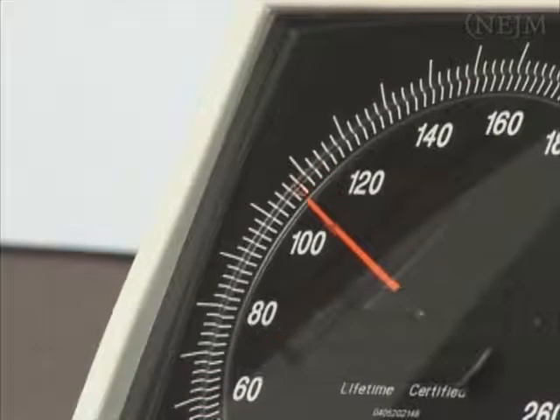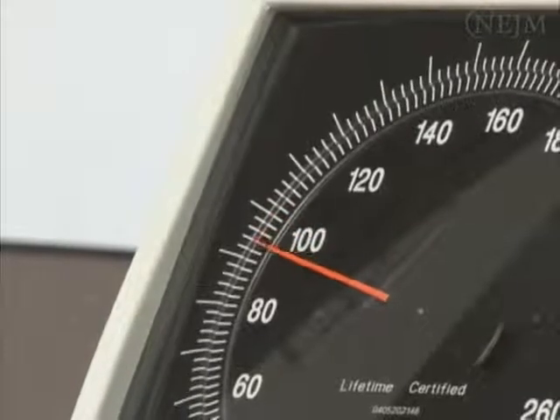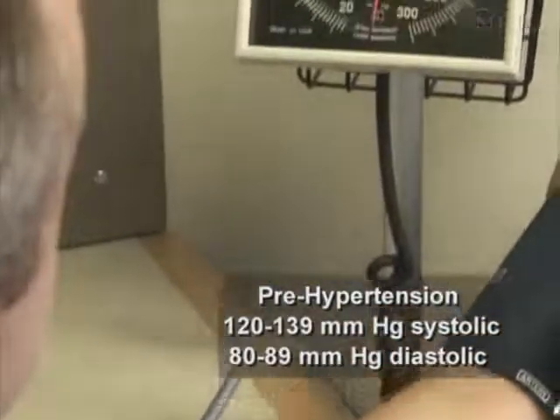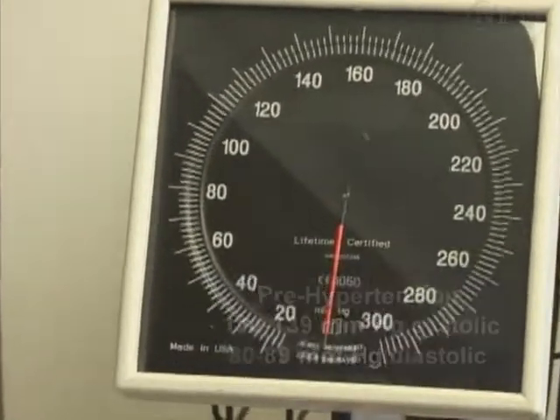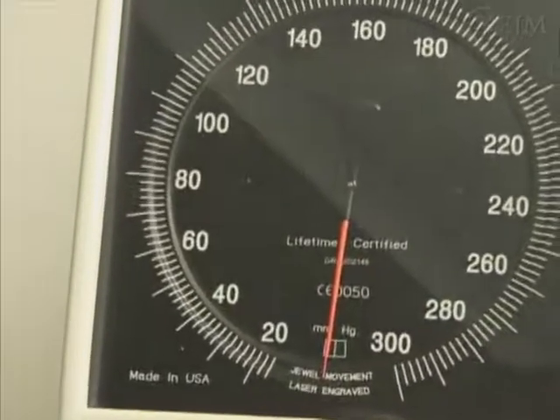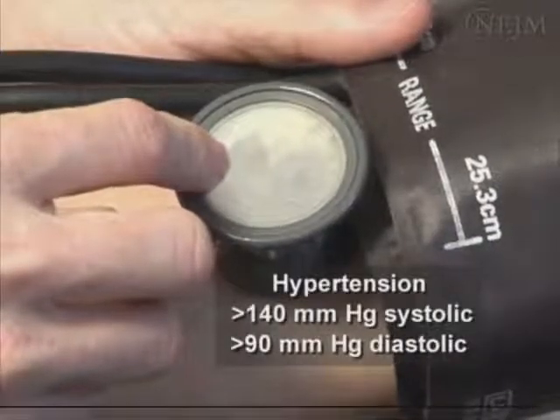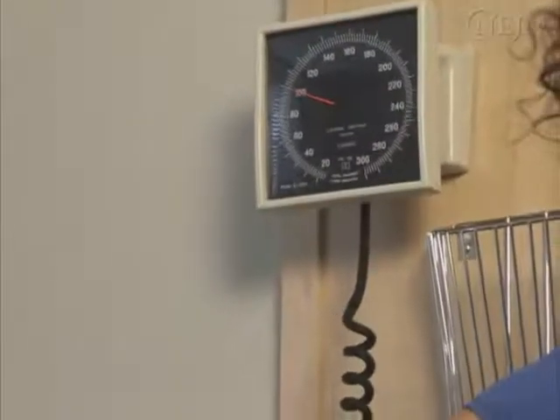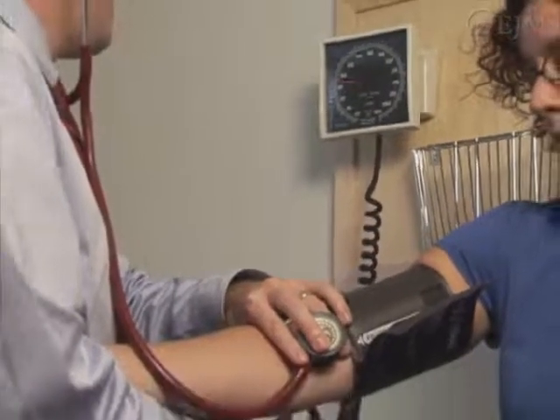Higher levels are classified as prehypertensive: a systolic blood pressure between 120 and 139 mmHg and a diastolic blood pressure between 80 and 89 mmHg. Hypertension is defined as a systolic blood pressure greater than 140 mmHg or greater than 90 mmHg diastolic. The purpose of this video is to demonstrate the appropriate technique for the indirect measurement of blood pressure in adults.